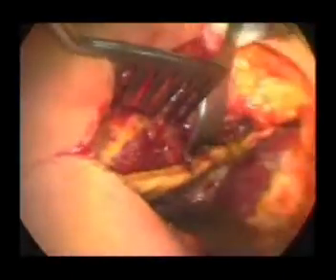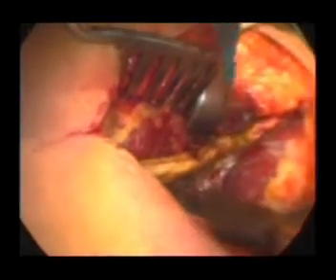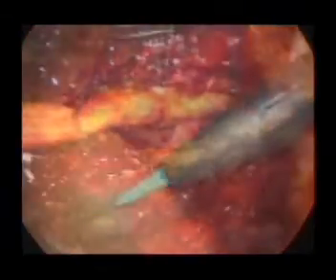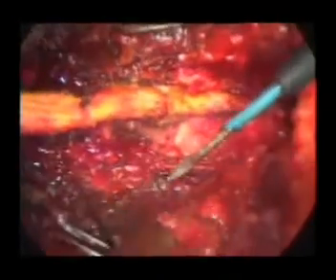Surgical exposure. A posterior midline incision of approximately 10 to 14 centimeters in length should be performed to create the proper exposure for implantation of the TOPS system.